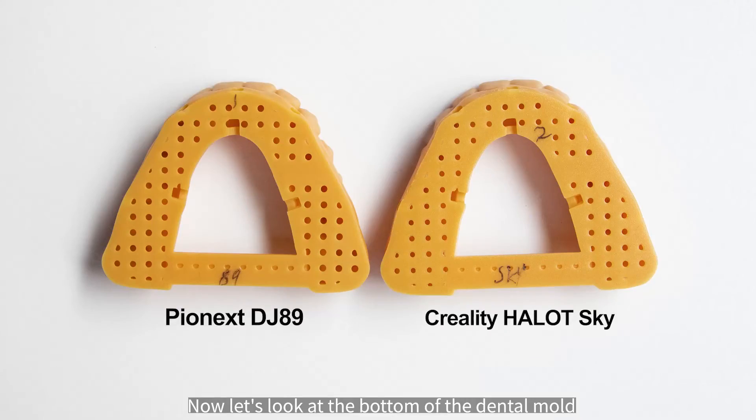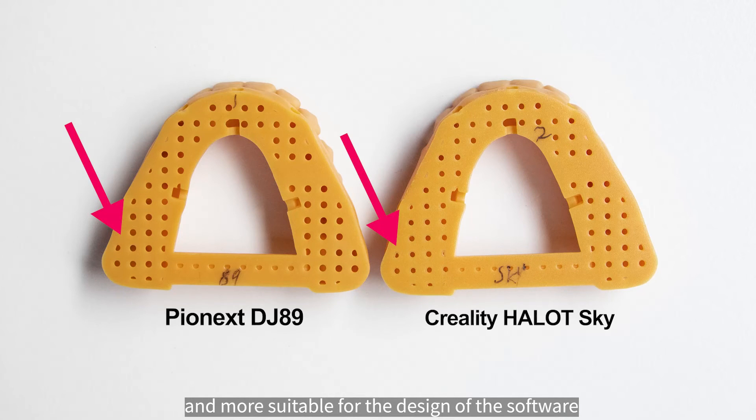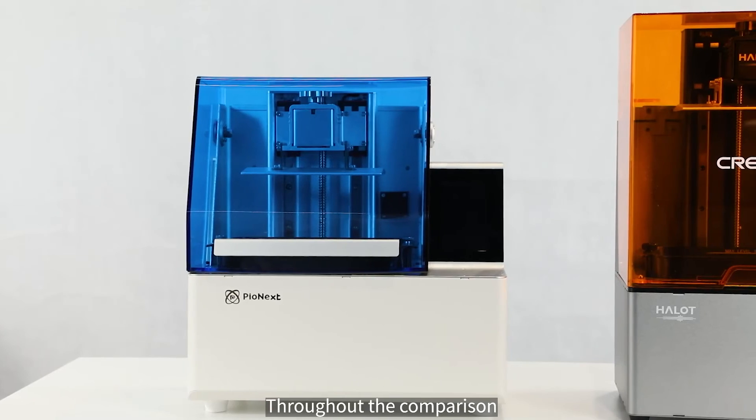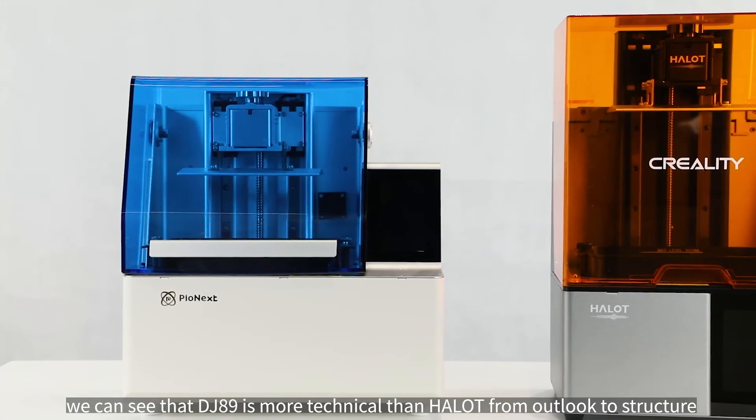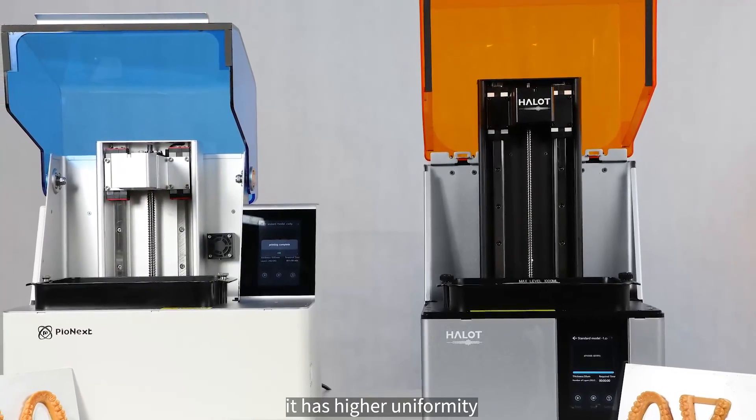Looking at the bottom of the dental mold, the holes printed by the DJ-89 are clearer and more faithful to the software design. Throughout the comparison, we can see that DJ-89 is more technically refined than HALOT, from outlook to structure, with higher uniformity.